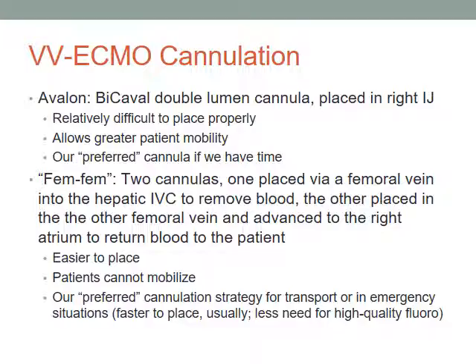You don't have to have real-time fluoroscopy to properly place. You don't have to have echocardiogram to place. And it's our preferred cannulation strategy in emergency or transport situations. We often will then transition the patient, when more stable, to an Avalon cannula from above.